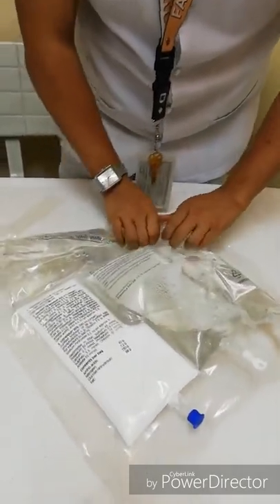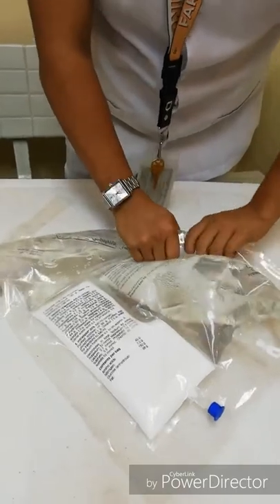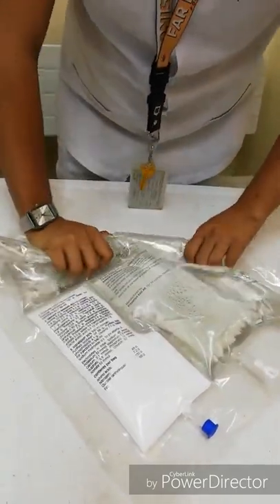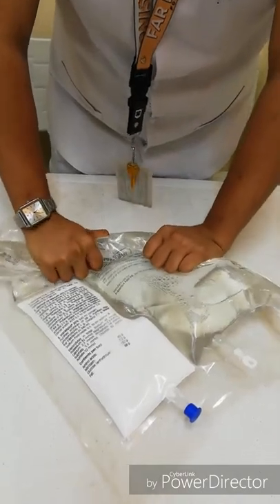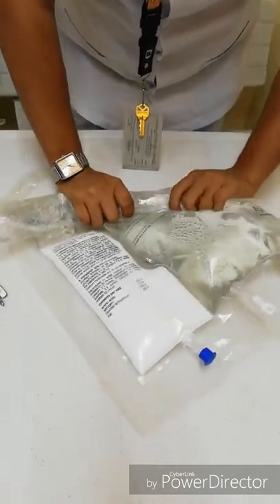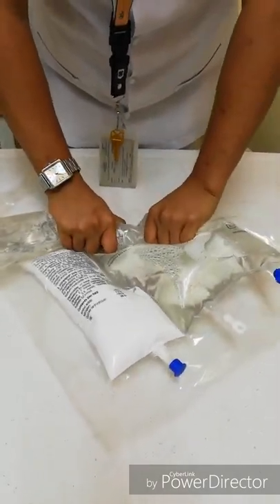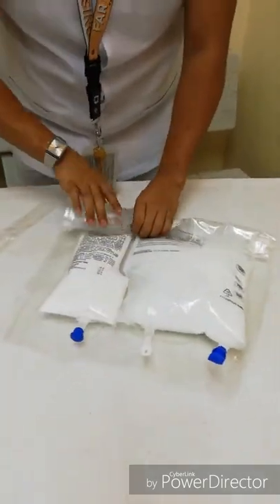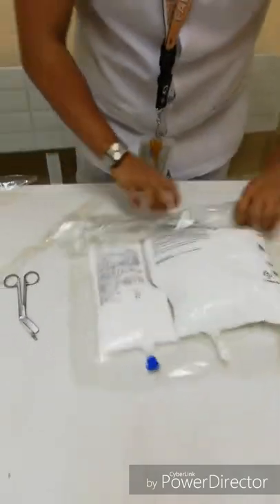Then you have to combine the water compartment with the TPN. Now I will be mixing the water with the TPN — just a little bit more — and now I will take the mixed TPN.